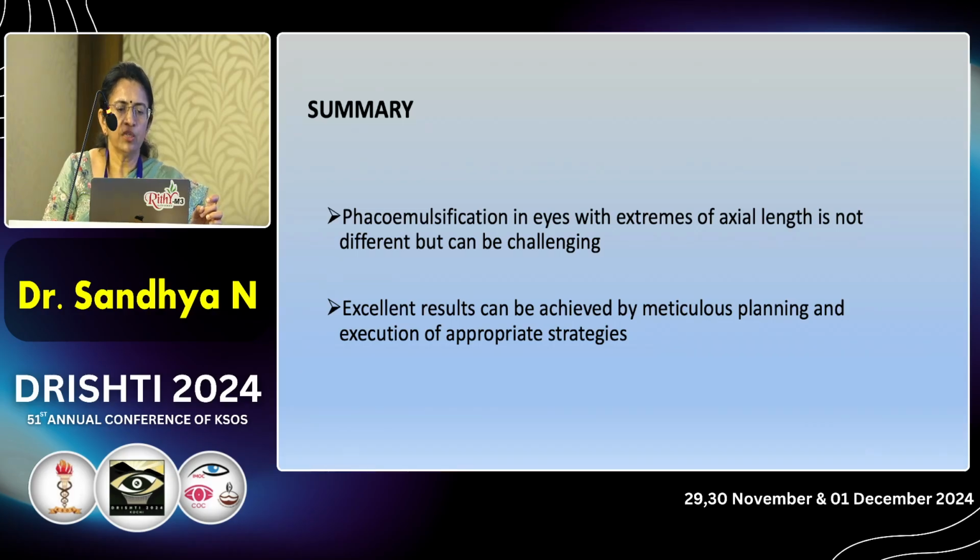So phacoemulsification in eyes with extremes of axial length is not different but can be challenging, and excellent results can be achieved by meticulous planning and execution of appropriate strategies.